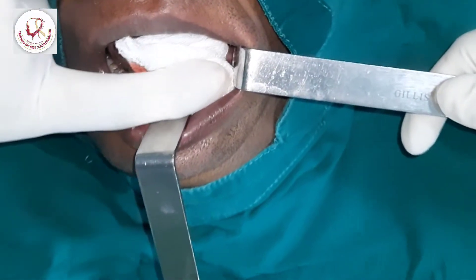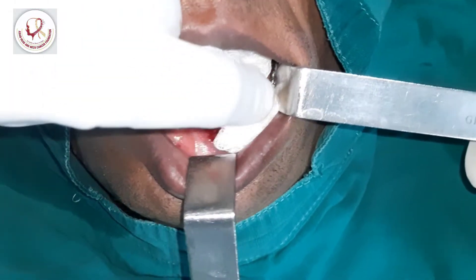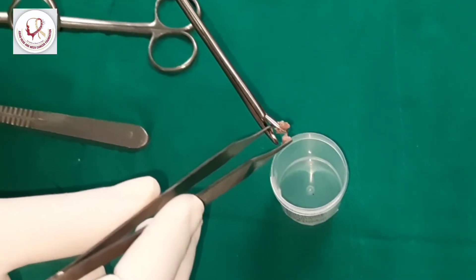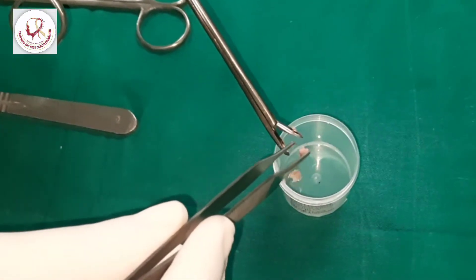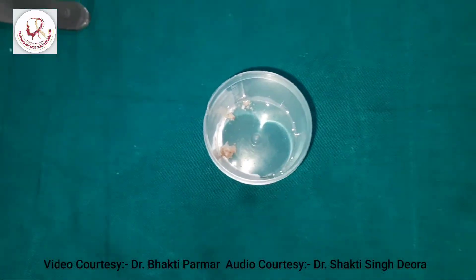For control of bleed, use betadine or hydrogen peroxide and just see there's no bleeding. This is the specimen in 10% formalin.